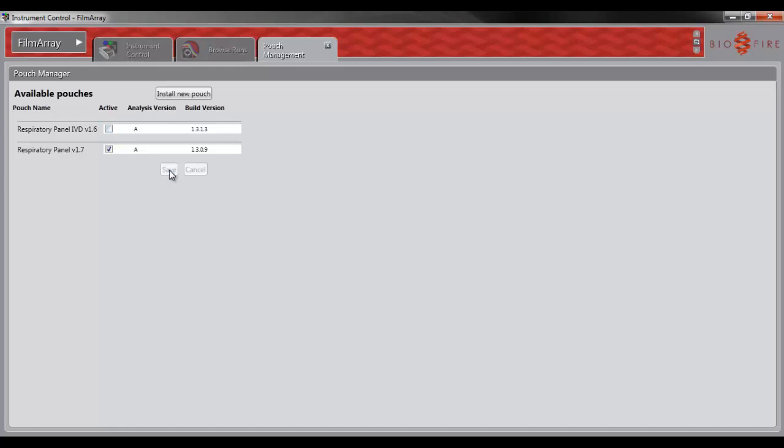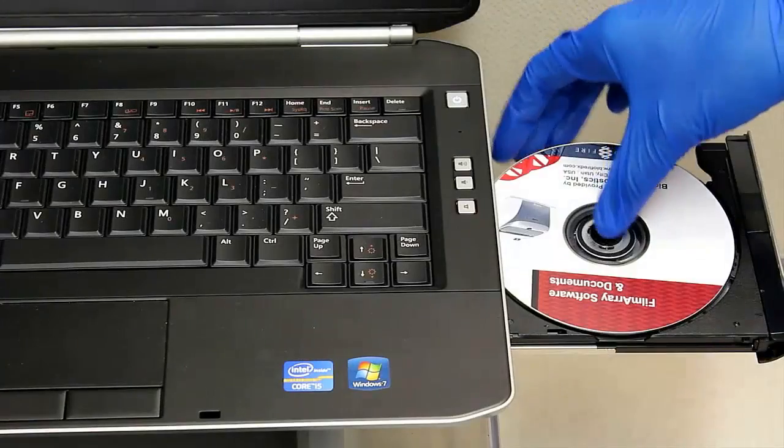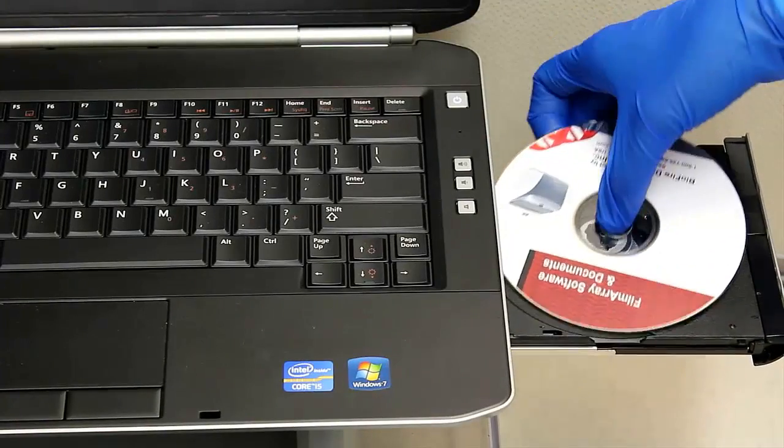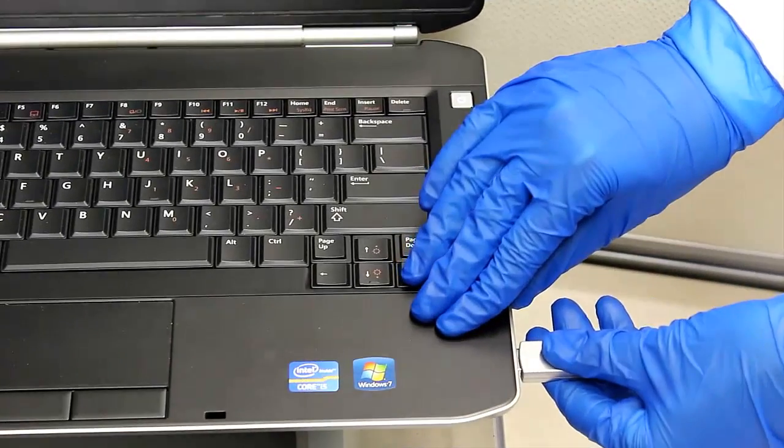This will remove the Pouch Type and Protocol option from the drop-down menu and stop you from accidentally running a pouch using the wrong protocol. You can now exit the Pouch Management tab and eject the CD or eject and remove the flash drive from the USB port.